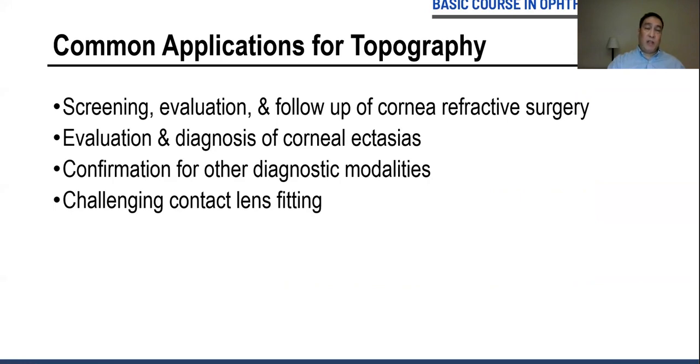Before, this was the number one indication, but there are nowhere near as many corneal ectasias as there are people who have had LASIK. And so now the common indication is refractive surgery. You can also use this for confirmation of other diagnostic modalities like keratometry. And of course, you use topography for challenging contact lens fitting.